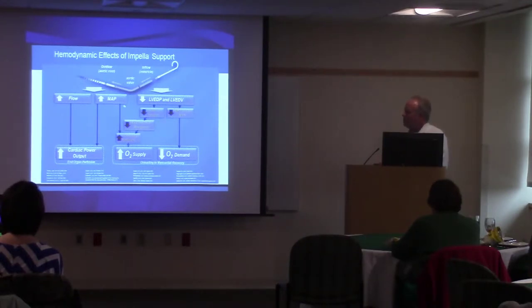It increases your pressure. MAP stands for mean arterial pressure. I'm going to be using that term a lot. Basically, it's just your blood pressure. So the pump will allow us to increase your blood pressure, which allows us to do more work on the heart. It decreases the pressure inside the heart.